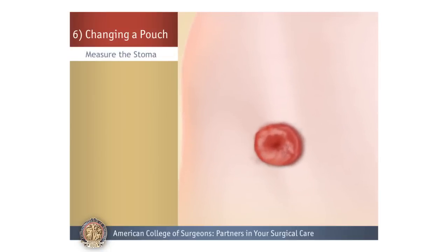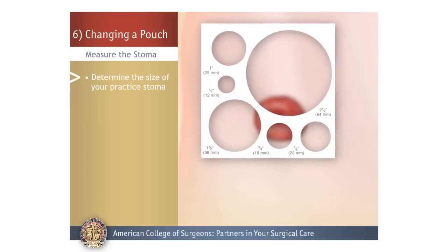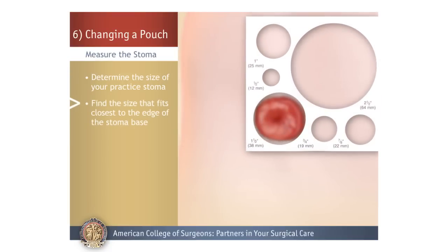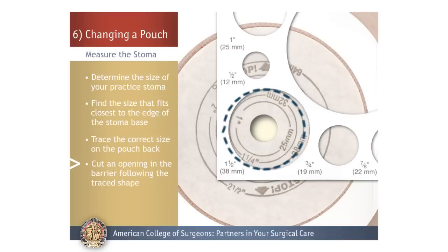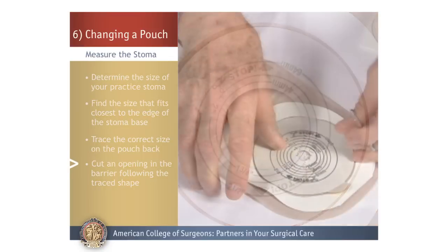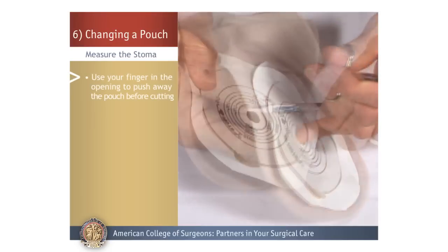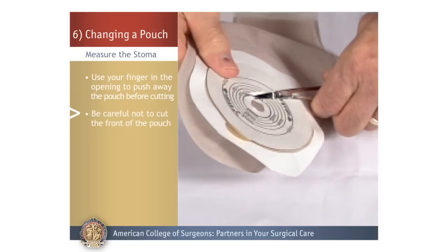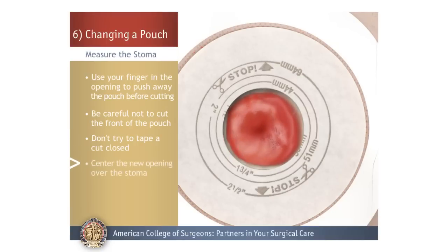Measure the Stoma. Use your sizing template and determine the size of your stoma by measuring your stoma practice model. Find the size that fits closest to the edge of the stoma where the skin and the stoma meet. Then place the template on the back of the pouch barrier and trace the correct size. Use the scissors to cut an opening in the barrier, closely following the traced shape. If you're using a one-piece pouch system, place your finger into the small pre-cut opening and push away the pouch before you start to cut — be careful not to cut through the front of the pouch. If you do cut the pouch, do not try to tape it closed, as it will leak and also emit odor. Center the new opening over the stoma to make sure it fits along the stoma edge.